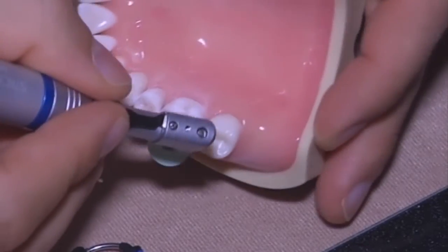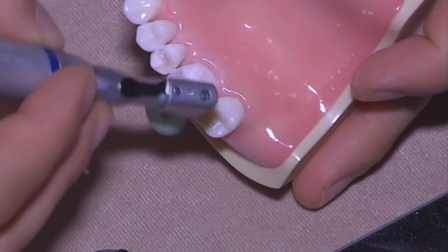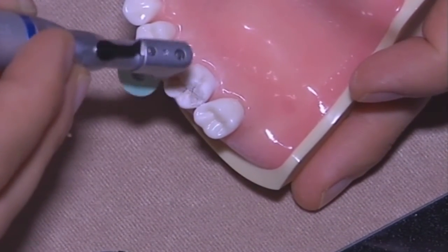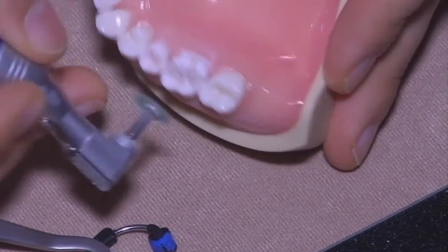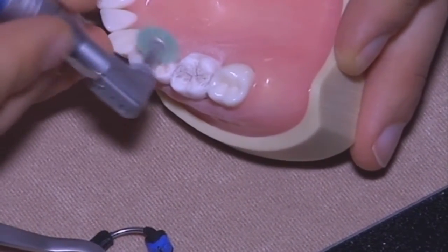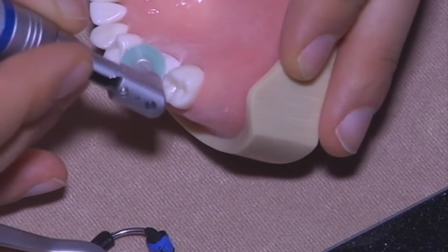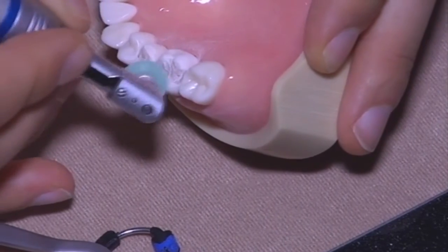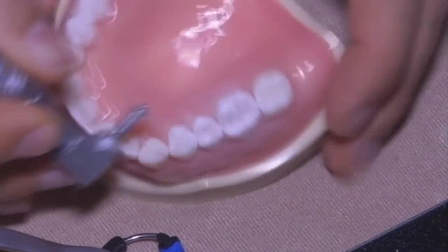Remember that if you have some excess on the occlusal margin of your restoration, you can also use a red ring diamond bur just to remove along the margin the excess of composite.